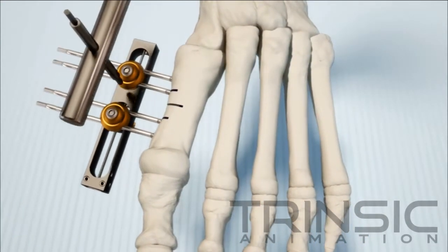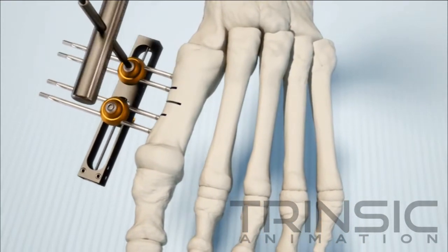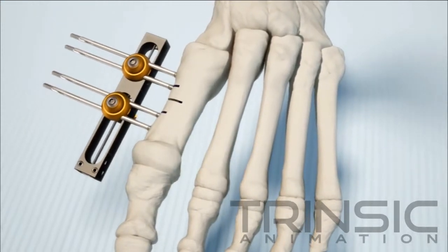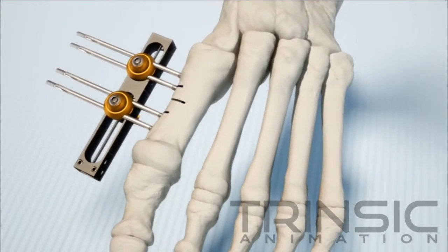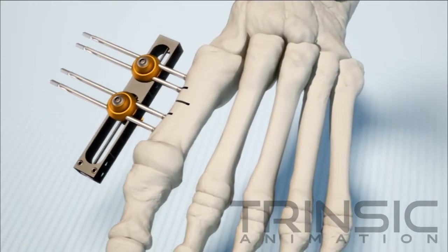Tighten the screws without locking them to allow the rail body free movement so that it can be aligned parallel to the metatarsal shaft. The screws should be loose enough to make the adjustment.